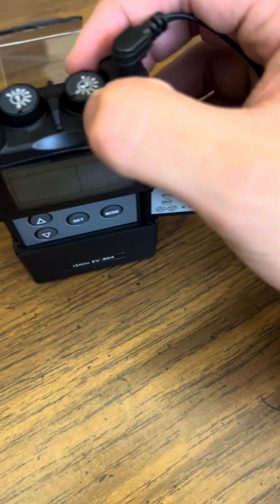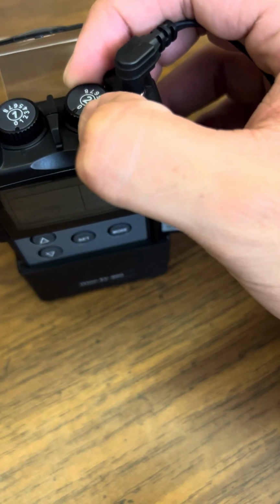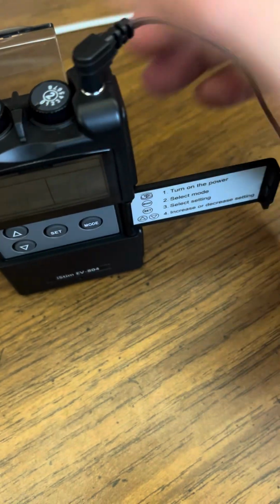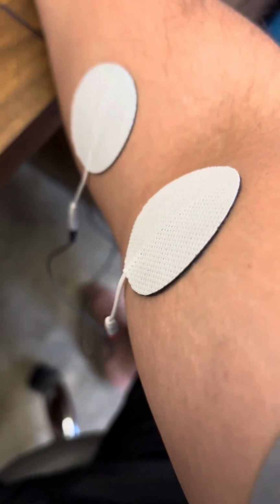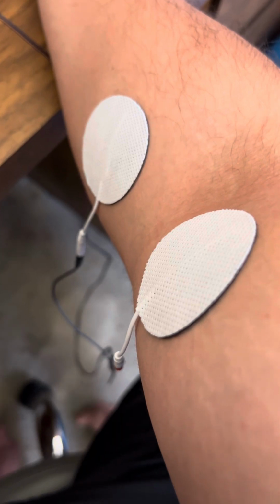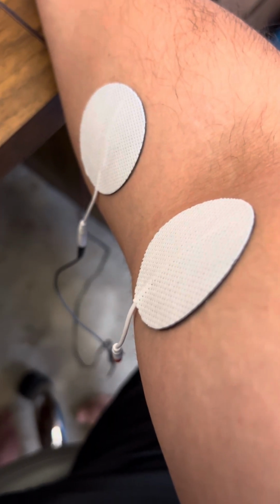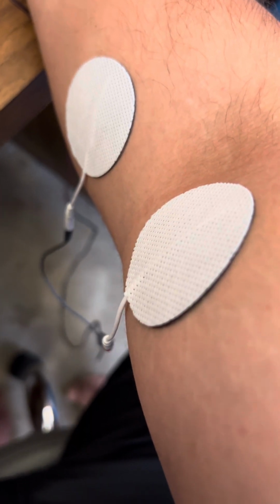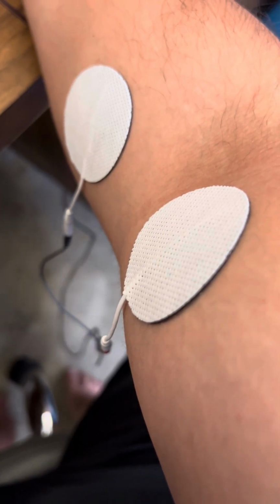In here, right? So I'm gonna go ahead and pump it up a little bit. Okay. So right there, I'm starting to feel more of the tingling sensation that I was talking about, right? And the good thing about this one too is that the patients kind of get to dictate the amplitude here. And yeah, so that's how you use the TENS unit.